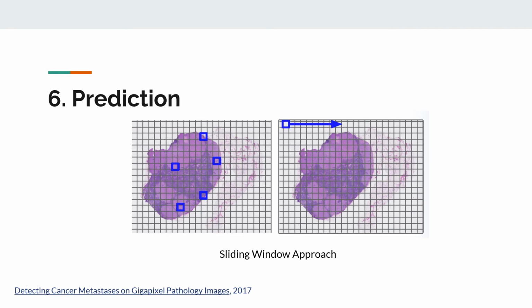For visualizing model prediction and localizing tumors, I used the sliding window approach. To implement this method, I extracted all patches of size 299 square at the corresponding level of magnification as sliding windows to make predictions. To be more specific, for each patch extracted, I first checked whether this patch contains tissue pixels. If yes, I would run prediction on it and classify it as tumor or normal. Then I plotted the tumor patches in red color by creating a separate mask, just like the original mask image.